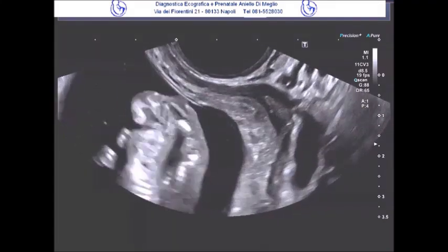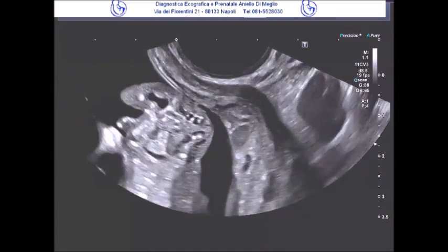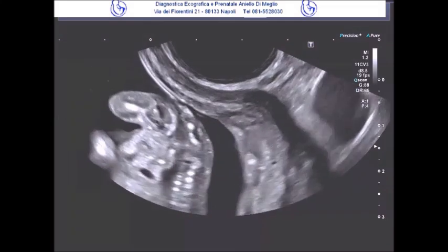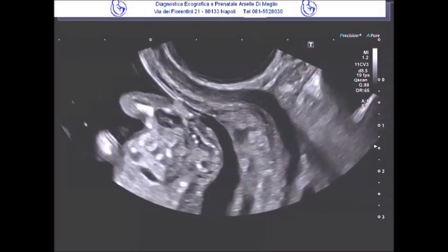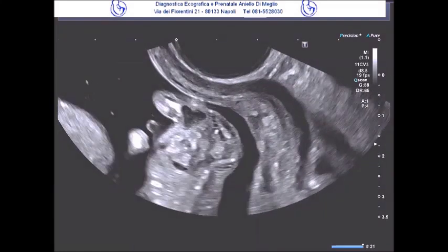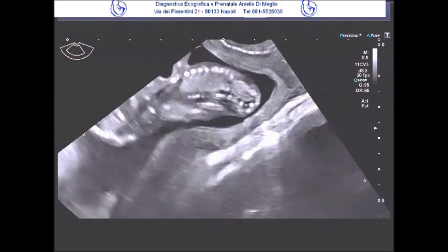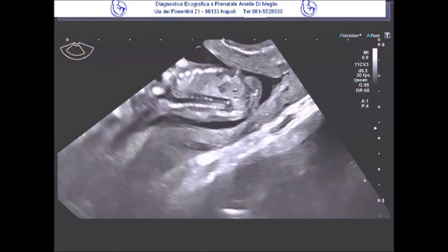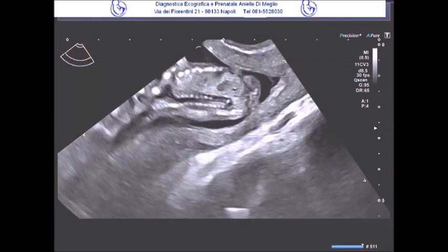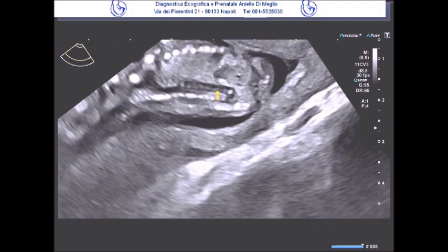of the posterior arches. It is precisely the extent of this cleft that explains the severity of the intracranial signs we saw a moment ago. The massive herniation of the rhombencephalon is, in fact, directly proportional to the amount of cerebrospinal fluid loss. In the coronal plane of the ultrasound scan, you can appreciate even more clearly the full extent of this spinal defect, as you can see how the axis of the spine is not just curved and deviated, but actually undergoes a significant and unmistakable interruption of its linearity.